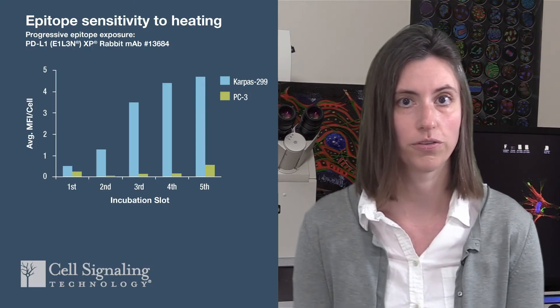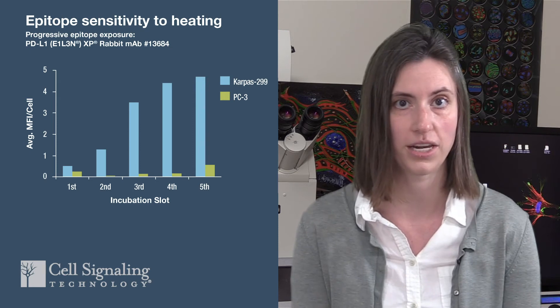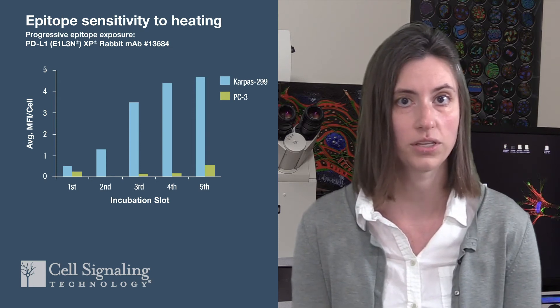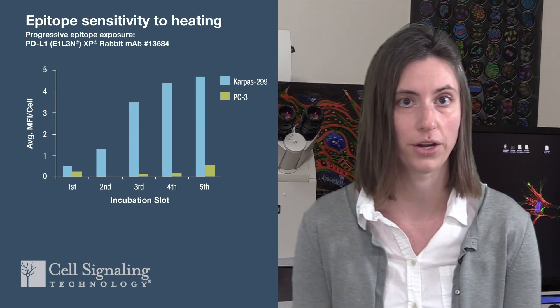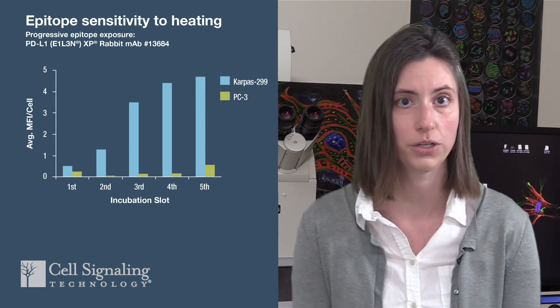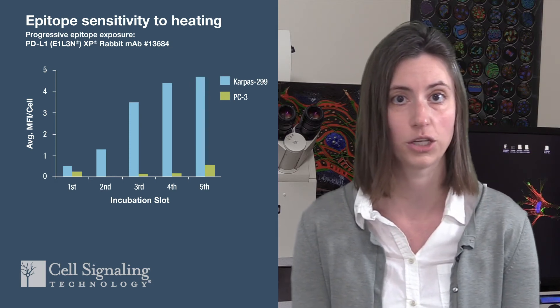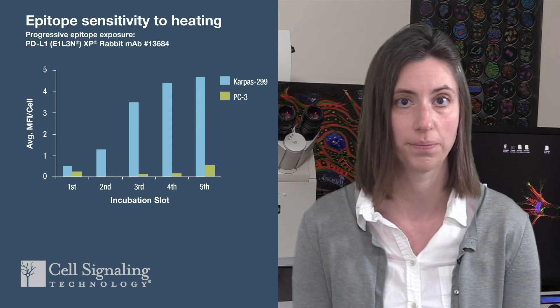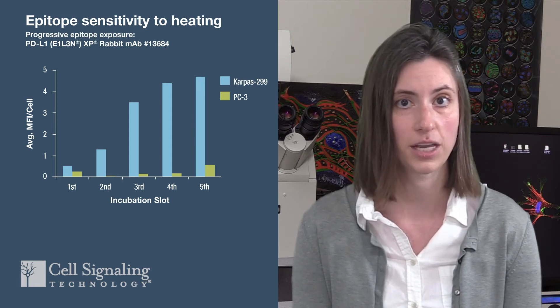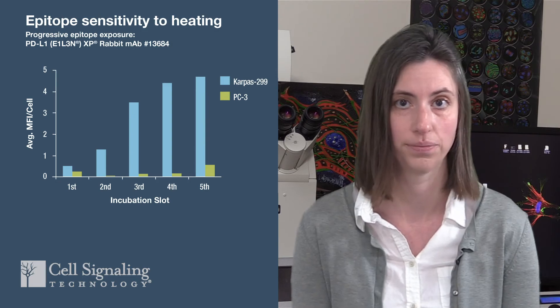This graph shows the fluorescence intensity of PD-L1 staining in positive and negative cell pellets. The PD-L1 staining was much brighter in the last slots compared to the first two, possibly due to the epitope becoming increasingly exposed during each round of heating. This is an example of an antibody that actually benefits from being stained in a later slot.